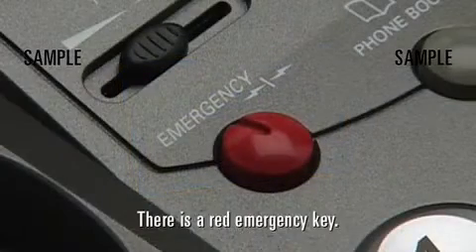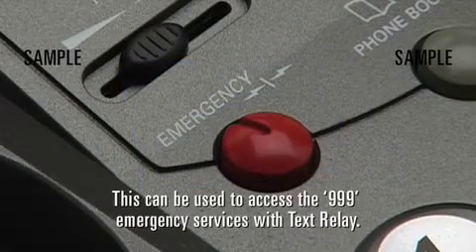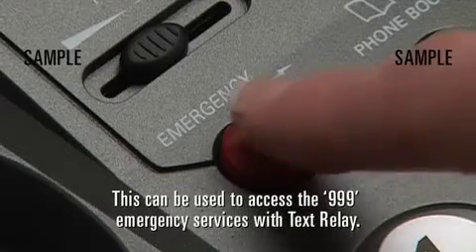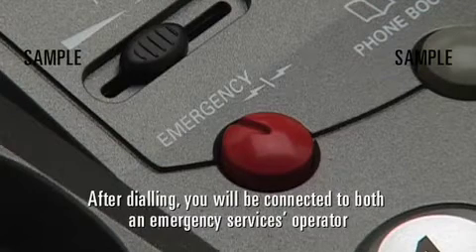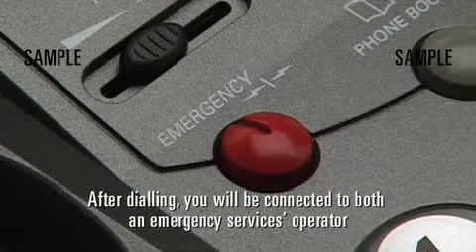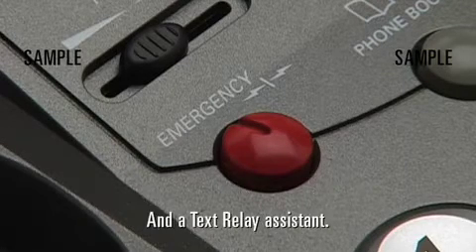There is a red emergency key. This can be used to access the 999 emergency services with text relay. After dialling, you'll be connected to both an emergency services operator and a text relay assistant.